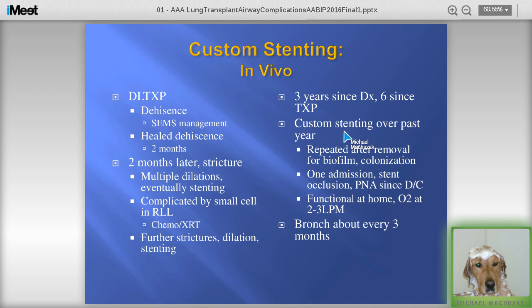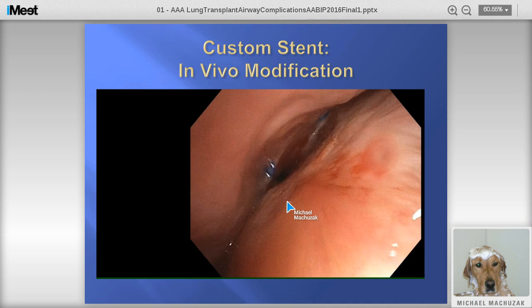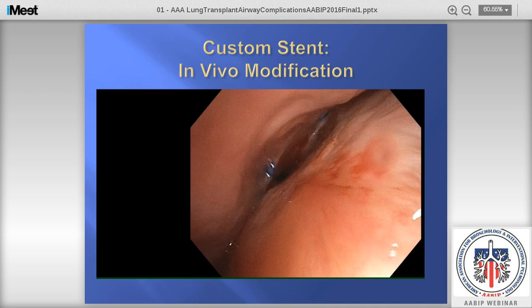We developed a custom stenting in-vivo approach for this patient. An iCAST stent is placed in the bronchus intermedius. In order to completely cover the involved areas, we had to jail the middle lobe and superior segment. I make a mental note of where those spots are, deploy the stent, and then use a CRE balloon to help the stent expand.